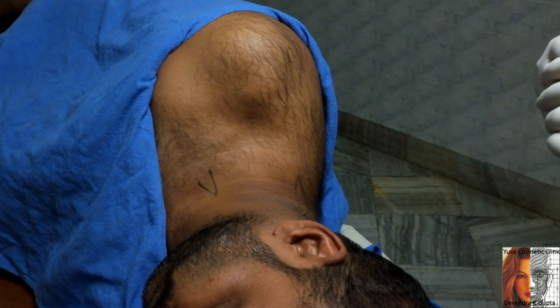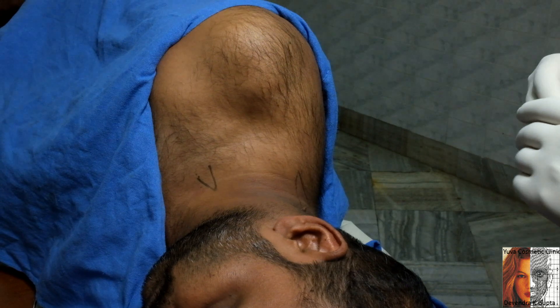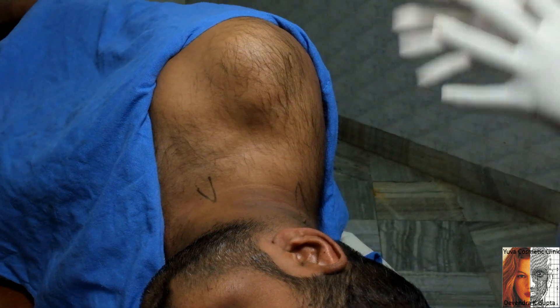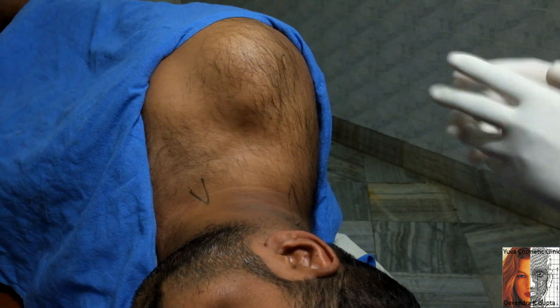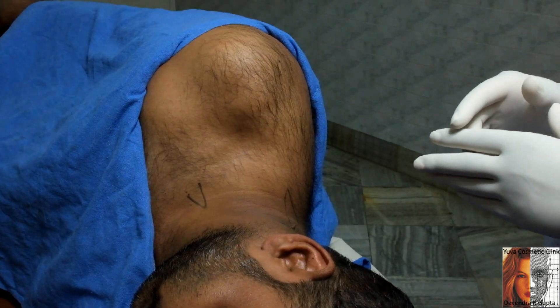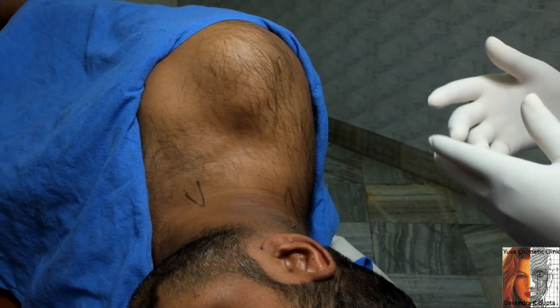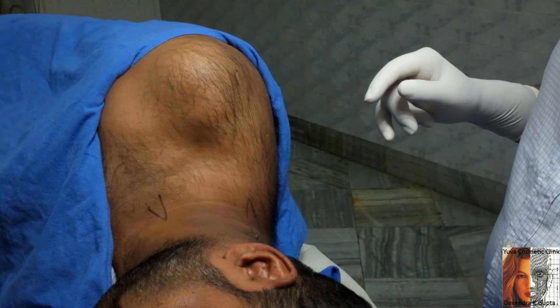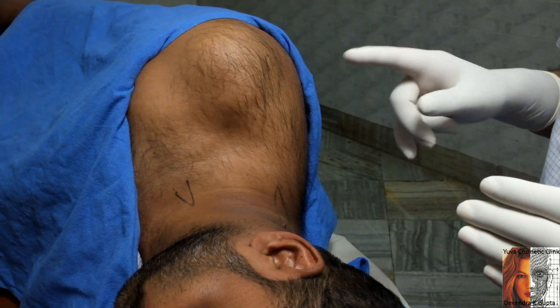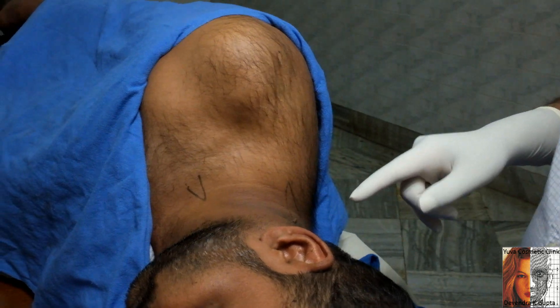He sustained accidental injury to his right hand with all the flexor tendons, both deep and superficial. This is about one and a half months post-injury. To enhance the recovery of the hand, I am going to give a sympathetic block along with a partial brachial plexus block. I am planning to give a cervical thoracic sympathetic block from the posterior approach.